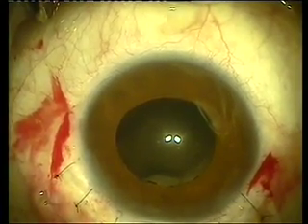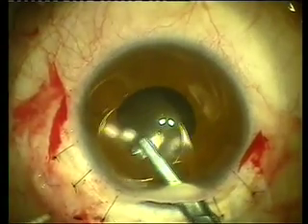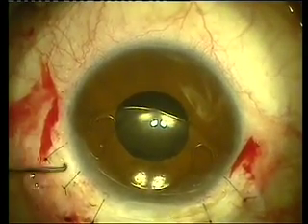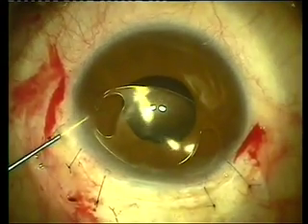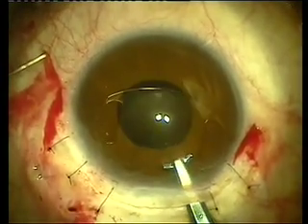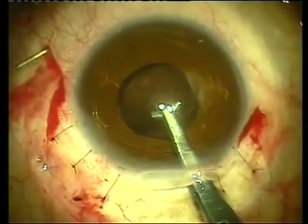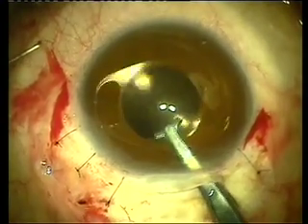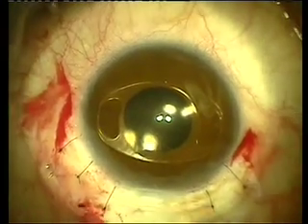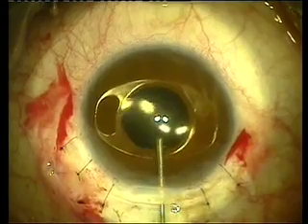A posterior intraocular lens could be sutured in place in a case like this. Over the last years, we have opted to place an Artisan Aphakia lens, as you can see here, due to the fact that this placement is a much easier surgical procedure. Also, the lens can be readily visualized in postoperative care and there is no risk of corrosion of the prolene sutures used in a sclerofixated posterior chamber lens in the future.